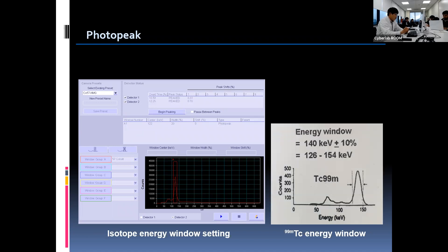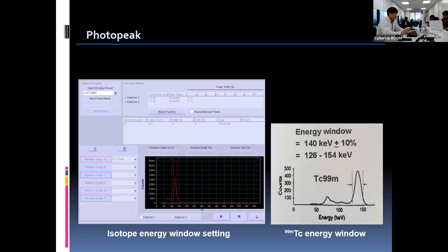Before starting any QC test or clinical imaging procedure, we have to confirm the isotope energy level we are going to use is centered over the proper photopeak. We can easily adjust the photopeak and energy window level on the acquisition setting page. We generally set a symmetric 20% energy window and photopeak of the isotope which is used for the study. For example, when we are going to use technetium, the energy level is centered on 140 keV, and the accepted energy range is from 126 to 154 keV.